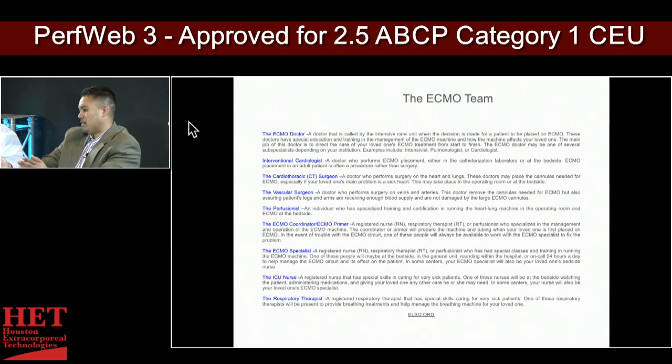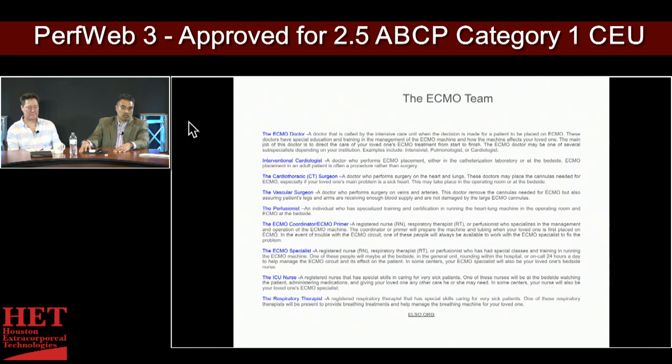And then you add this ECMO in, which we are the specialists. We are the extracorporeal membrane oxygenator specialists, if you will. We are blood propelling, VA ECMO, VV ECMO. Again, we talked about, we know the anticoagulation, we know our membranes. We get to pick our circuits.